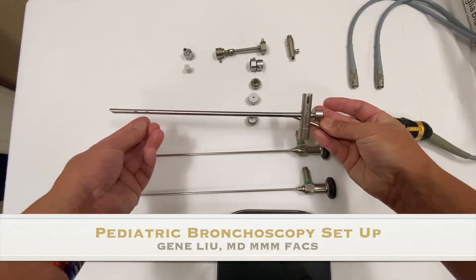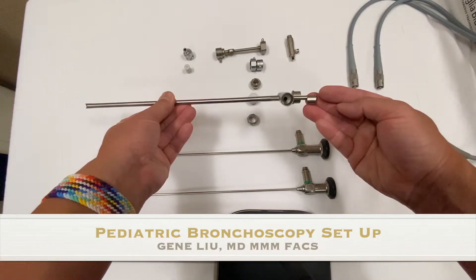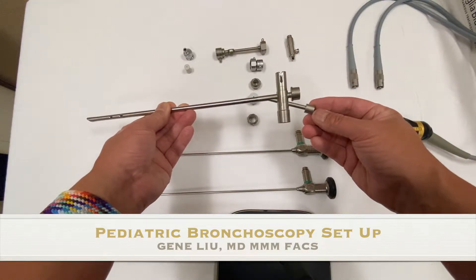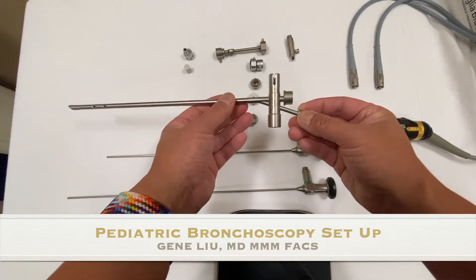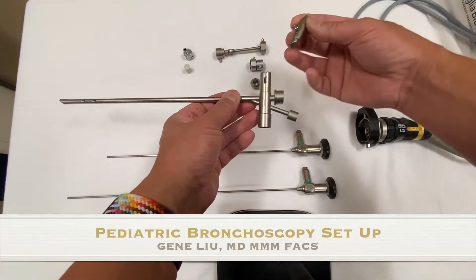Here you can see in the front that there are two side ports that facilitate and enhance ventilation. In the back on the bottom is where the anesthesia circuit attaches. On the top is a hole for the prism. The prism is what you use to reflect light into the tube of the bronchoscope if you're going to use it with your eyeball instead of the telescope.